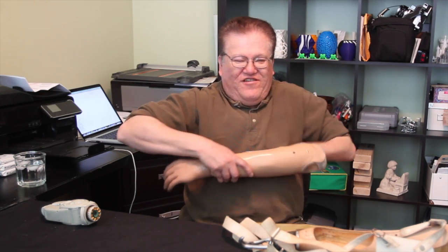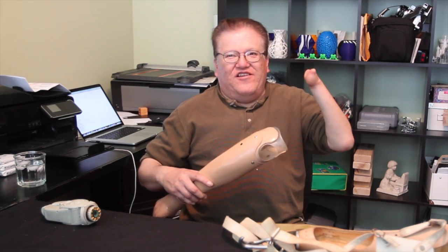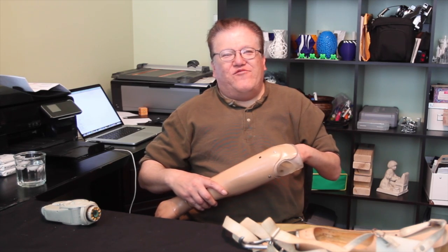My name is Jose Delgado Jr., I'm 53 years old. I was born without a left hand — I'll show you. And I'm here at Jeremy Simon's house, and he's making me a — not a robotic, but a 3D hand.